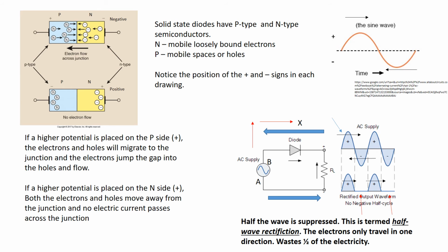And then what does electricity want to do then? AC? Well, now we're going to flow again from A through the resistor. The electrons can flow against the arrowhead to B, so we get another hump. There's the second hump on that bottom drawing. And then we start to flow from B going to A, but electrons cannot flow with the arrow, so they're stopped.